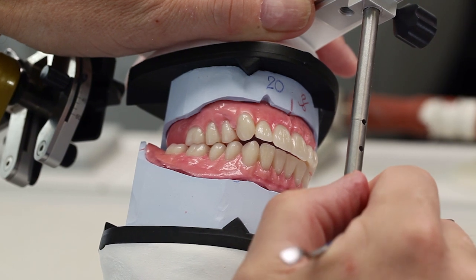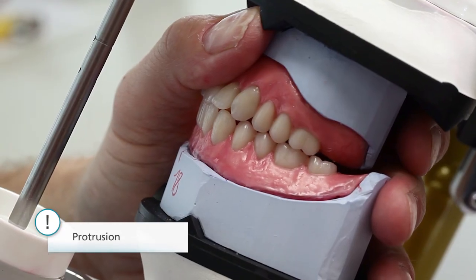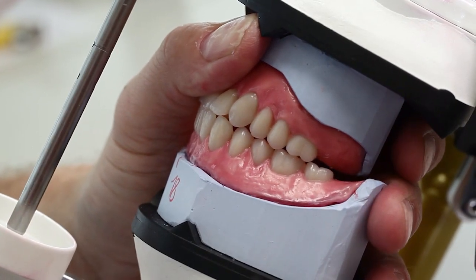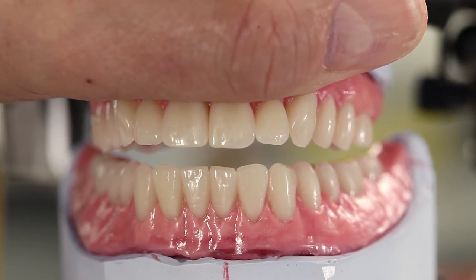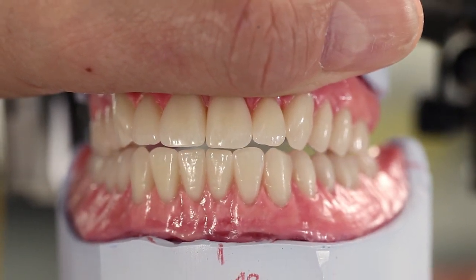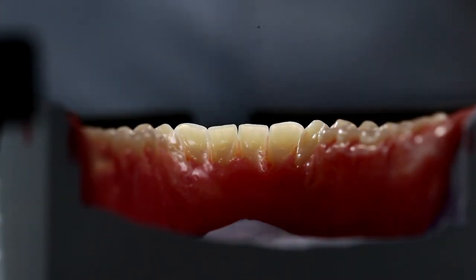The mesiopalatal cusps of the upper molars slide on the disto-buccal cusps of the lower molars. The disto-buccal facets of the upper premolars slide over the mesio-buccal facets of the second premolar and the first molar. Set up or grind in the anterior teeth in such a way that they come into group contact with the posterior teeth. Premature contacts must be avoided. Prevent a mere anterior and canine guidance in any case.